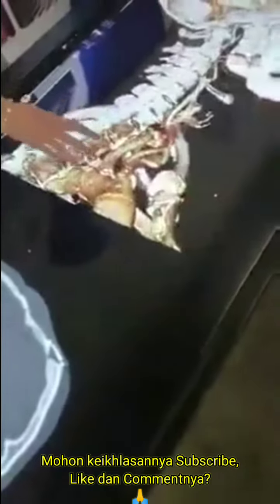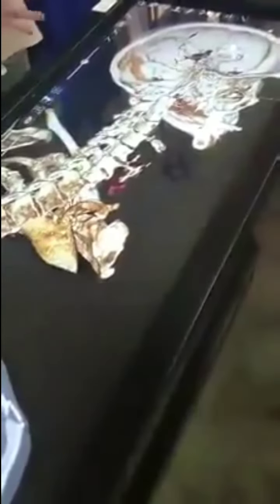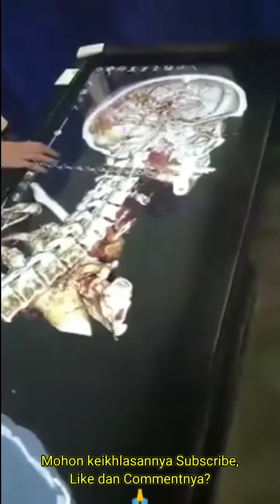And same functionality as before. You can go ahead and make a quick cut into the 3D model and see where the clips were placed as well. So it's kind of more intuitive when you see something in 3D, where the clips were placed rather than just focusing on a CT. And you can also add in some vasculature if needed. And you can also move it back down. There's other ways where you can utilize this where I bring in transparent soft and hard tissue. And so in this case, you still see where the clips were placed.